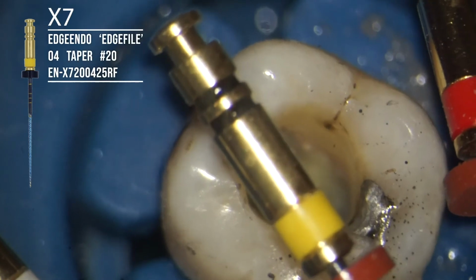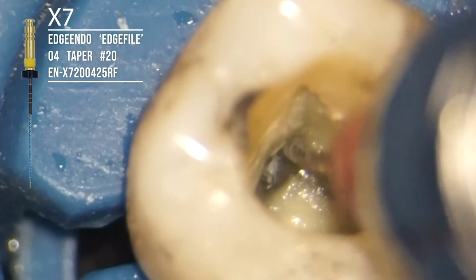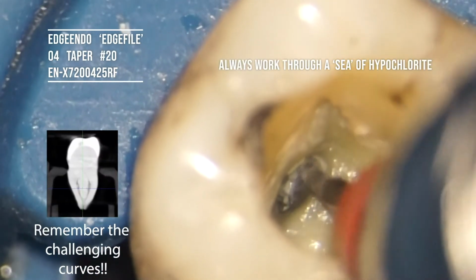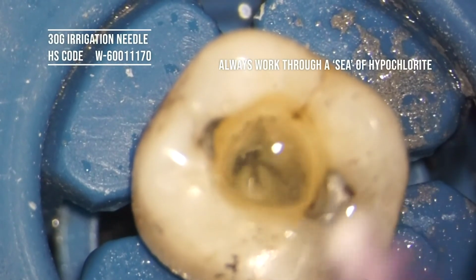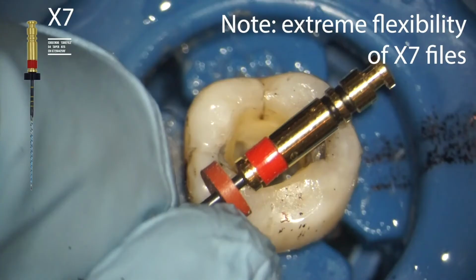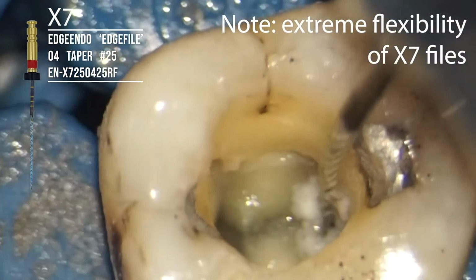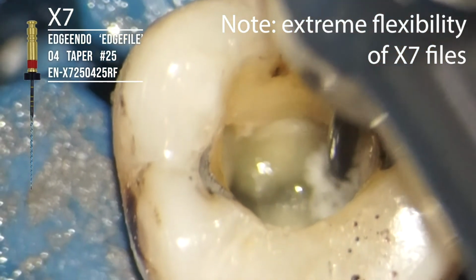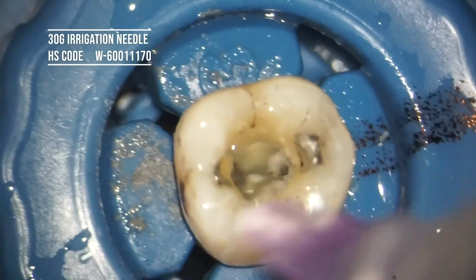Now the 04, size 20, first in our series. Look how flexible these files are. Literally, they just slide to working length and preserve that pericervical dentine just beautifully. Remember, always I should be working through a sea of hypochlorite. I just wanted to demo the really nice ability of the files. And look here how flexible this file system is. Amazing, especially on uppers when you're working into the buccal root system, how easy it is to pre-bend those files and just slide them straight into the buccal roots. And irrigate, irrigate, irrigate. Sodium hypochlorite 3%.